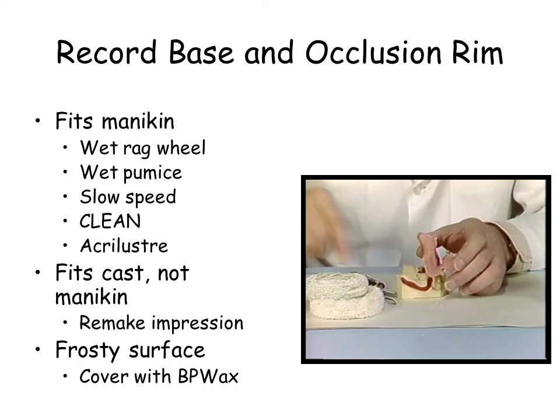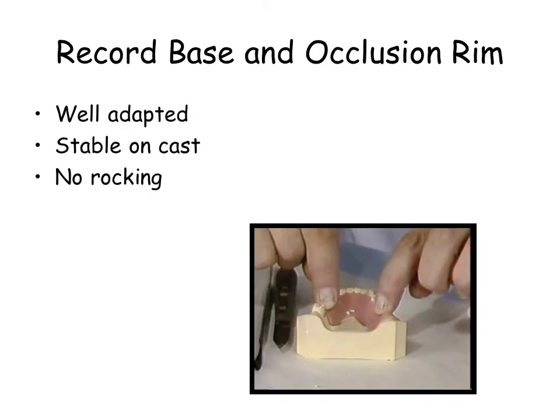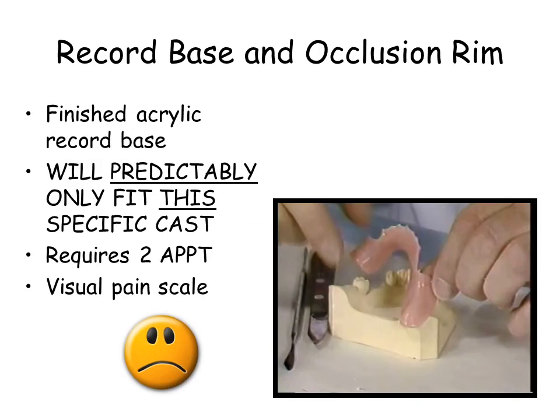The finished record base should be stable on the cast and patient, with no rocking. The finished record base will reliably fit only this diagnostic cast, and should not be expected to fit other casts. It requires 2 appointments. The acrylic continues to cure and should be made well in advance of its intended use.